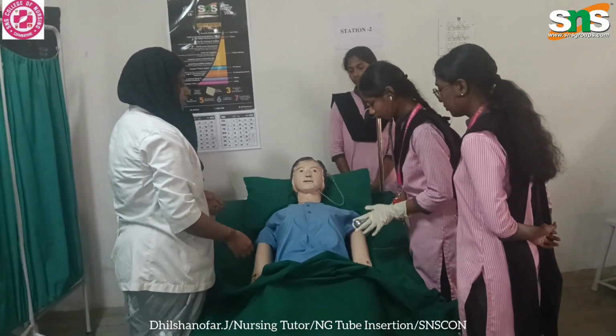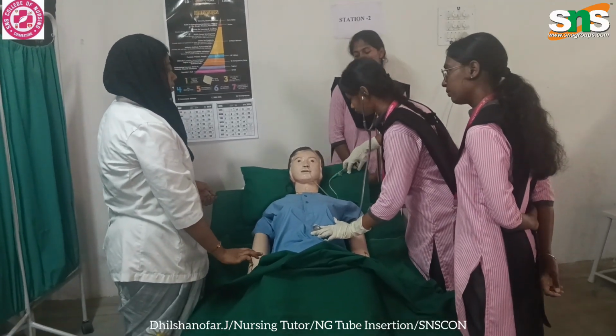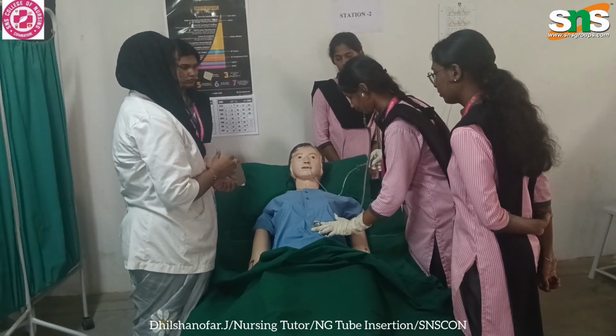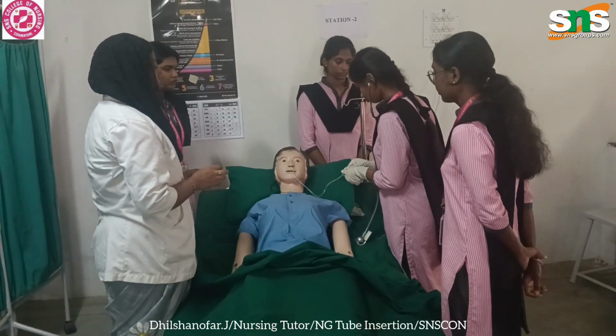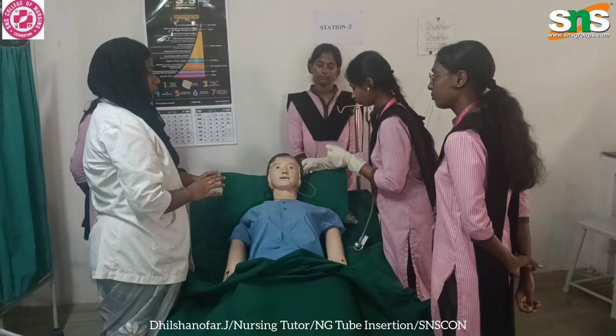You should place the stethoscope on the upper abdomen. Then when you push the air, you will hear the air sound. If you hear the air sound, it is in the normal position.